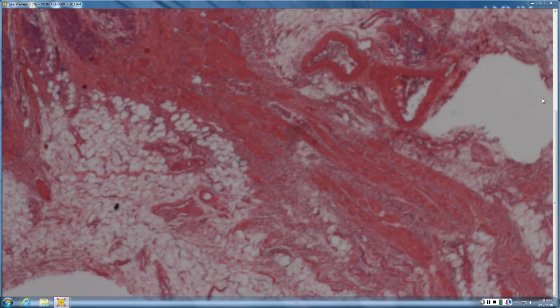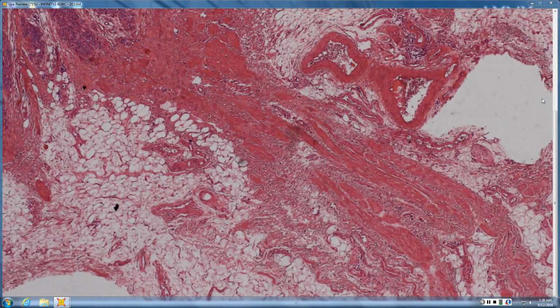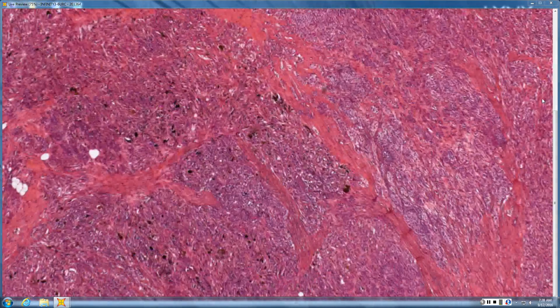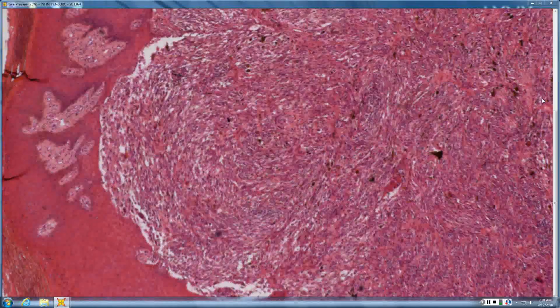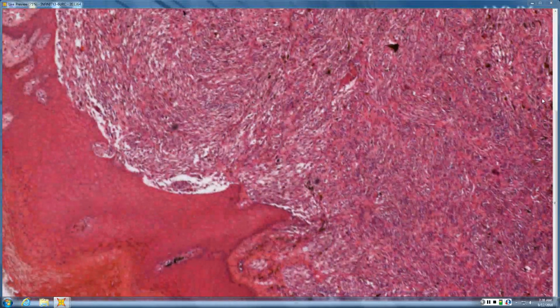And the Spitz component is intradermal, so you don't have the pseudoepitheliomatous hyperplasia and all of those things that you get with a compound or junctional Spitz. So the hyperkeratosis, acanthosis, all of that you lack with the dermal Spitz.